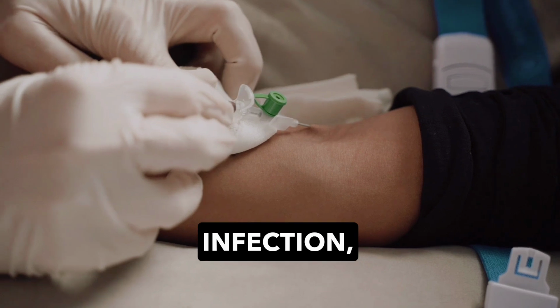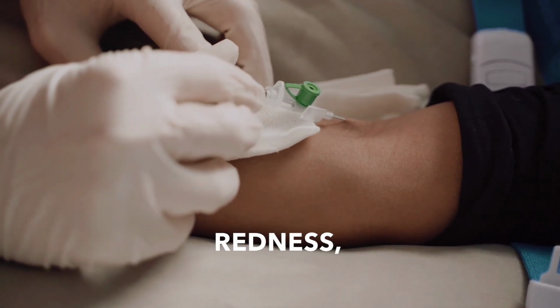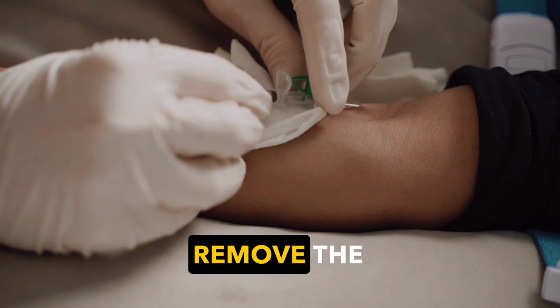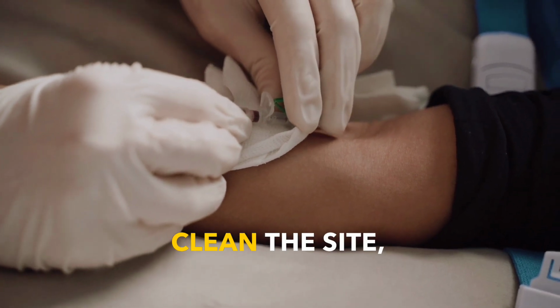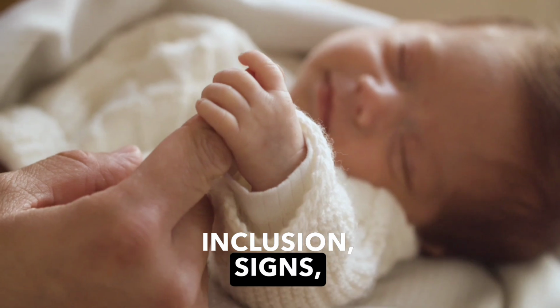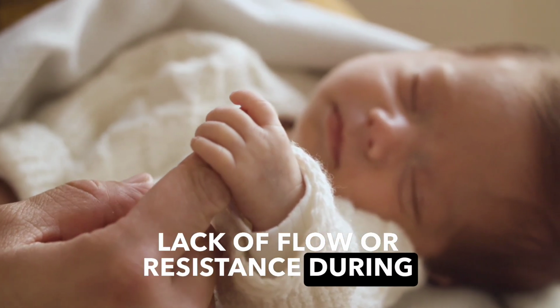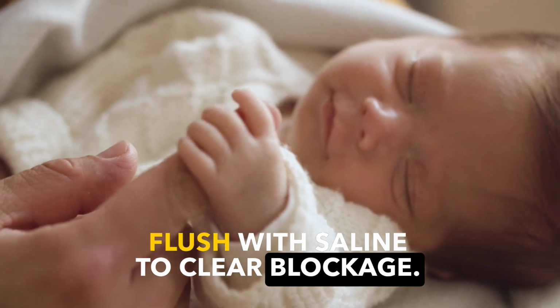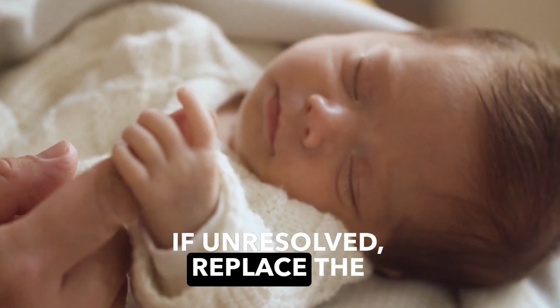3. Infection. Signs: redness, warmth, discharge, or fever. Action: remove the cannula, clean the site, and notify the physician. 4. Occlusion. Signs: lack of flow or resistance during flushing. Action: flush with saline to clear blockage. If unresolved, replace the cannula.